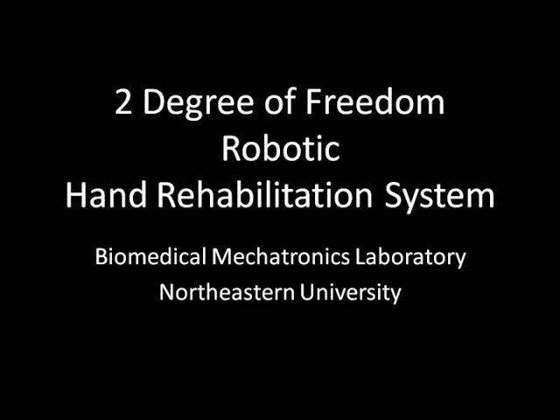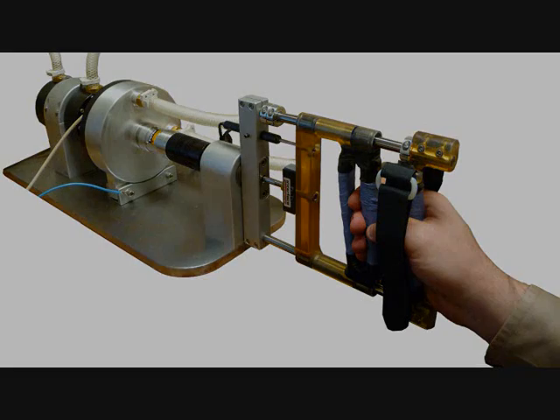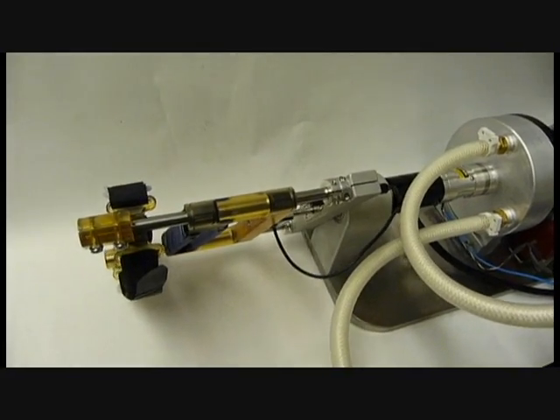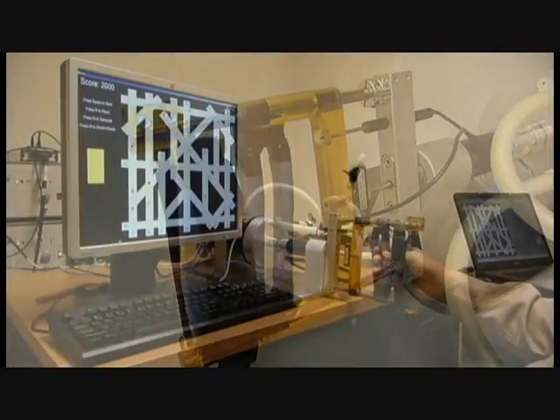The 2 Degree of Freedom robotic hand rehabilitation system, developed by the Biomedical Mechatronics Lab at Northeastern University, is a hand rehab system controlled by 2 hydraulic actuators focused on restoring hand and wrist movement for stroke patients. The actuators assist in the linear and rotational directions, allowing the user to exercise pronation supination of the wrist as well as flexion extension of the fingers.